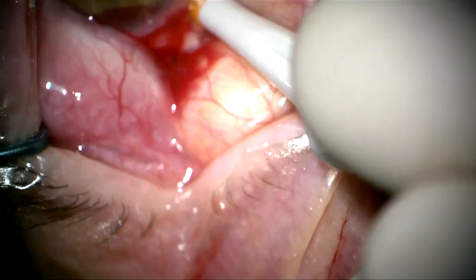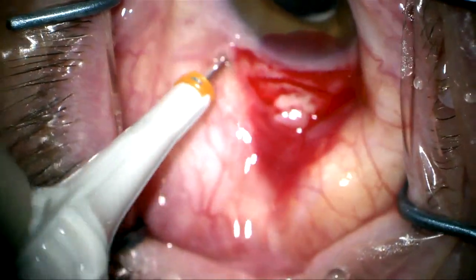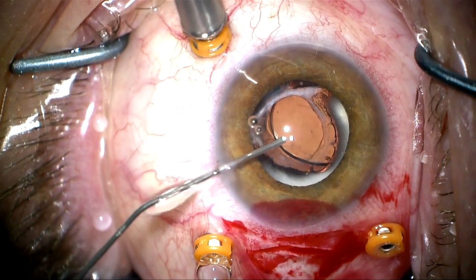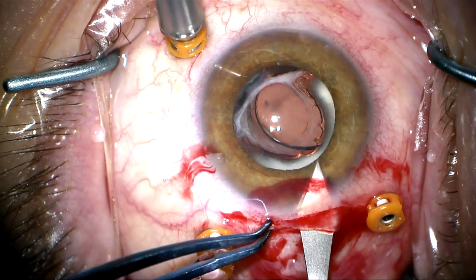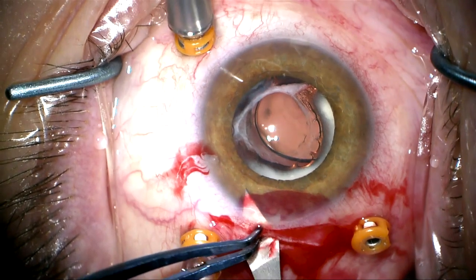This lens is sitting in the anterior vitreous behind the anterior and posterior capsule, which are fused together with the large Soemmering's ring. We're going to disperse the viscoelastic in the anterior chamber and create a self-sealing internal opening. This is very important so we have control of the eye throughout the procedure.